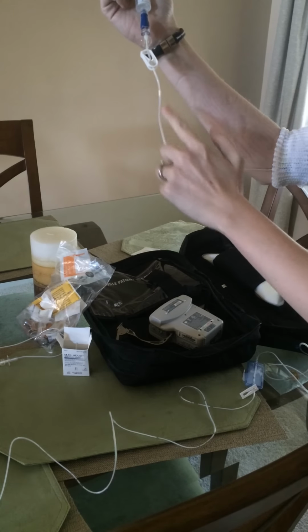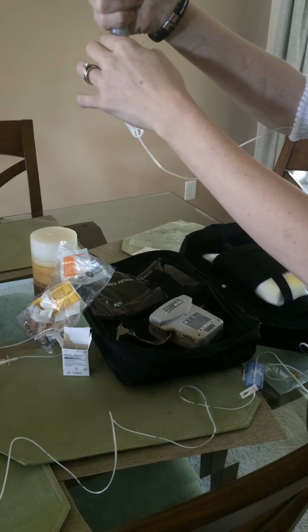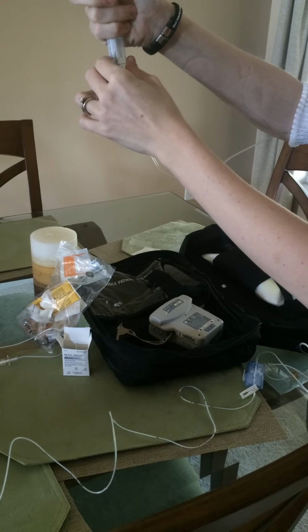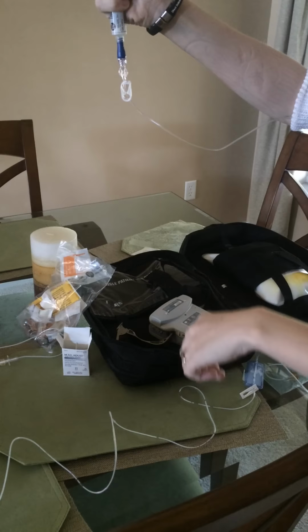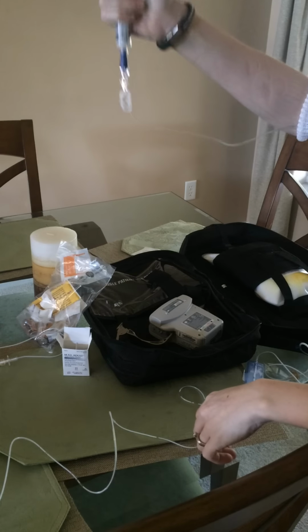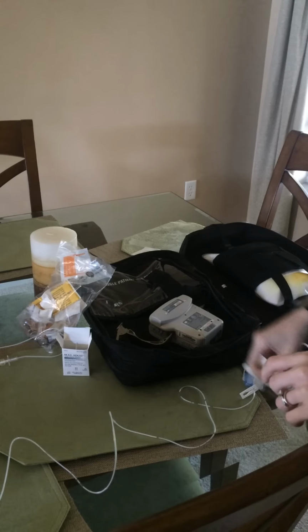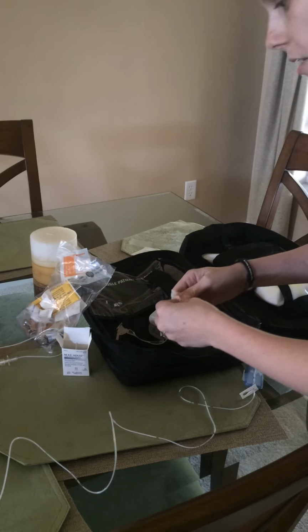Unclip this and you're going to see this go. It needs force of pressure to make sure there's nice pressure going on. I can actually feel it and taste it as it goes through. And I stop short. Clip so no air goes through. I usually leave this at the end just to prevent any more air to go through.